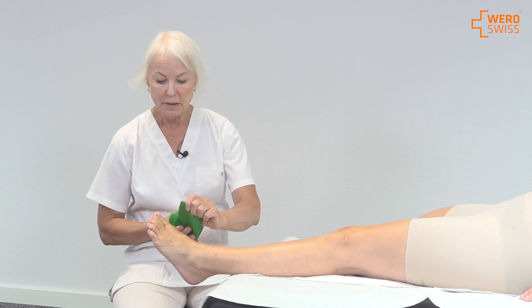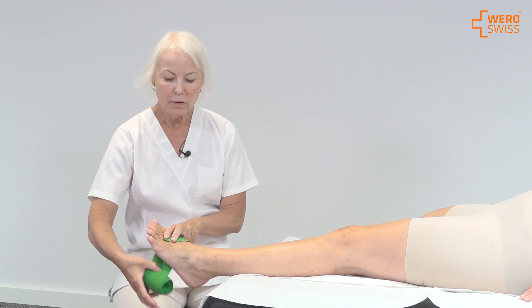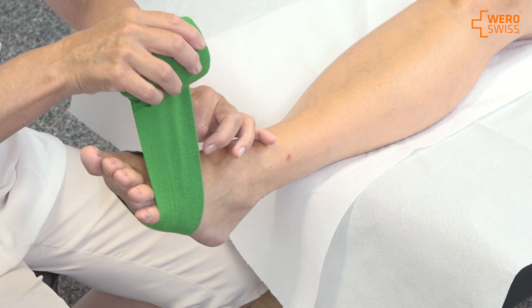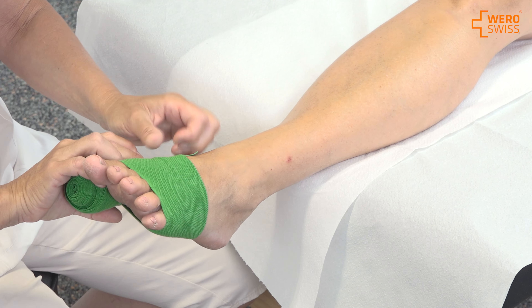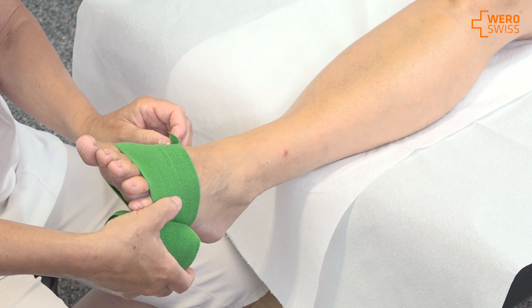Start at the toe base. The angle of the bandage is pointing to the patient. When you go over the second overlapping, you turn the flap so the bandage stays properly and does not glide up or down.